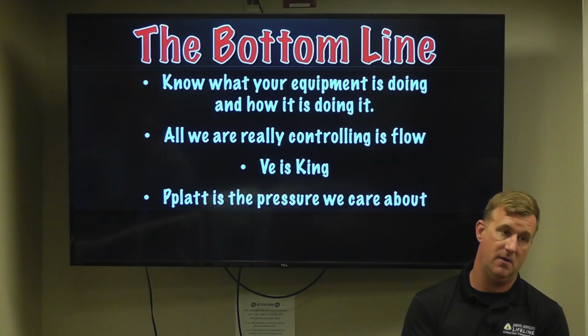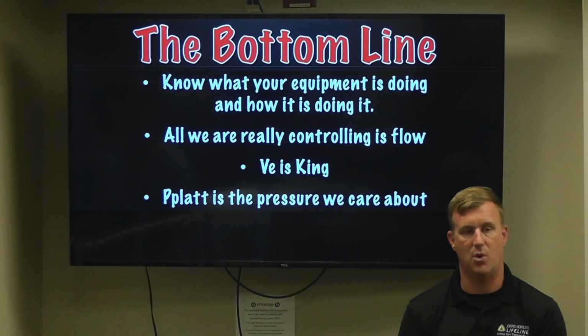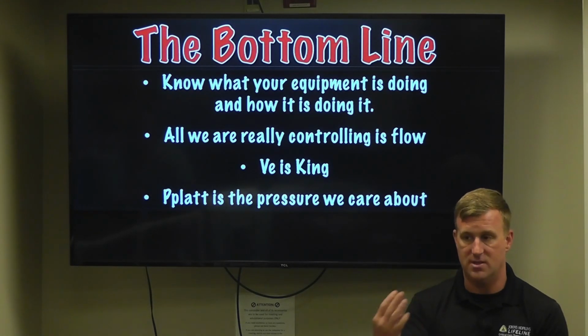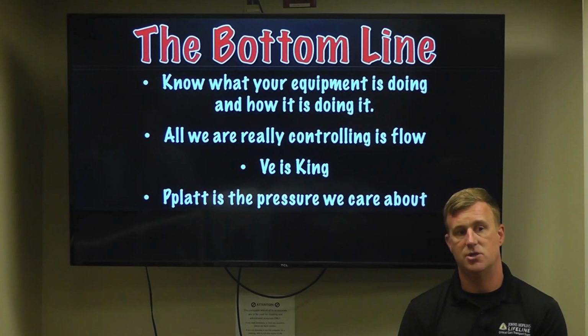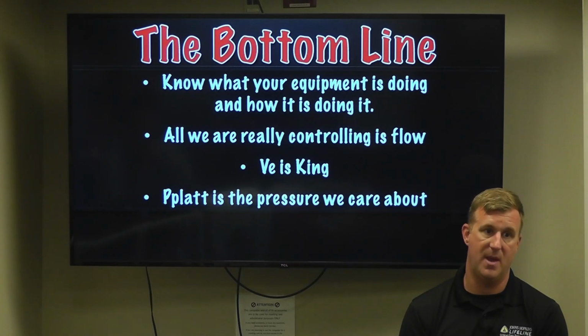On the other hand, volume and how you deliver your volume is going to matter a lot more for your asthma patient, because they can't get air in or they can't get air out, and they're having a hard time getting air in. And if you try and force that air in, all you're going to do is be bumping up against that tight airway. So going to a volume ventilation can really be a benefit for them.